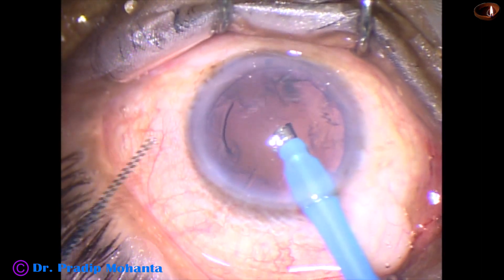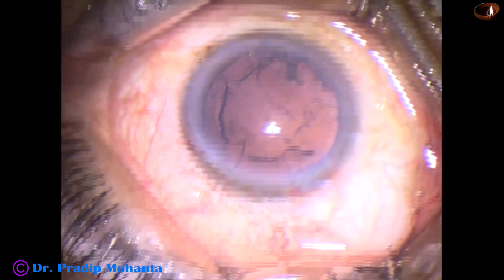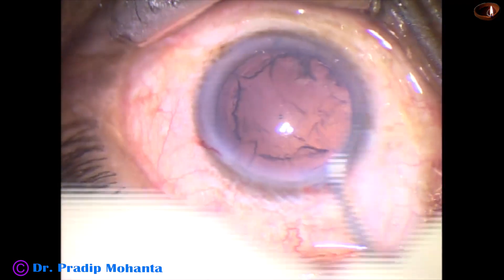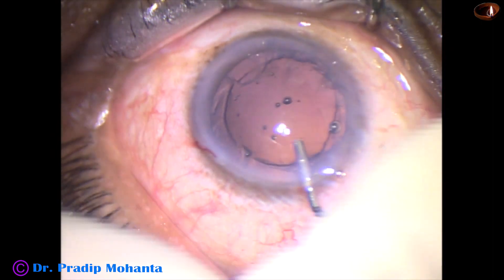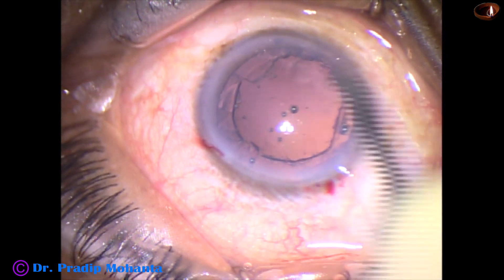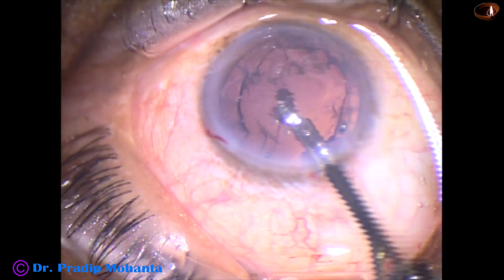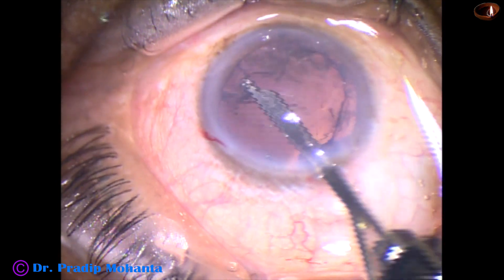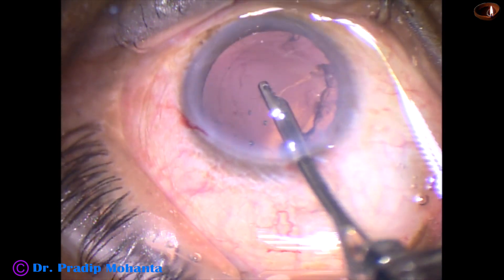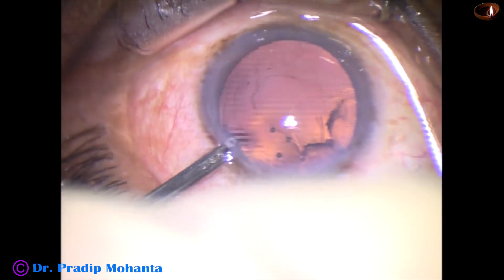Nucleus and epinucleus is managed, and now the handpiece is removed from the anterior chamber. 2% HPMC is injected to fill the anterior chamber. It has two purposes: one is to protect the corneal endothelium, and the other is to maintain the anterior chamber depth when aspirating with the Simcoe cannula. The visco comes out gradually and maintains the depth of the anterior chamber.